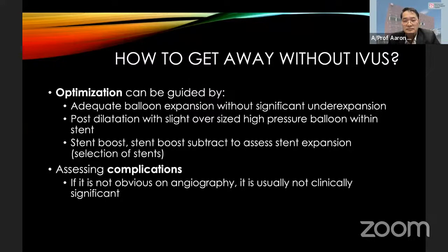Stent boost subtract can be used to assess stent expansion. And it also depends on the selection of stent as well. Some of the stents are more radio opaque than others. And also later on, the stent expansion limit is quite important as well. So assessment of complications, to me, is quite simple. If it's not obvious on angiography, it is usually not clinically significant.